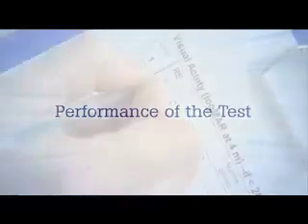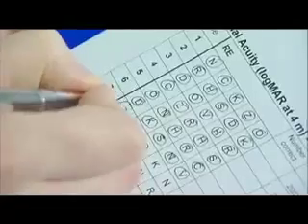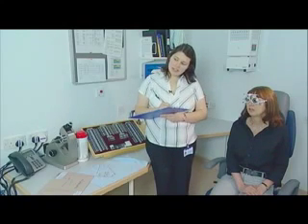The clinician circles each correct letter on the record chart, held conveniently on a clipboard. Incorrect letters are left unmarked. The ETDRS test is highly standardized, and in order to perform it correctly, the clinician must encourage guessing where there is uncertainty. The clinician should also remind the patient that there are no numbers on the chart if the patient calls out a number, asking them to identify the letter instead.